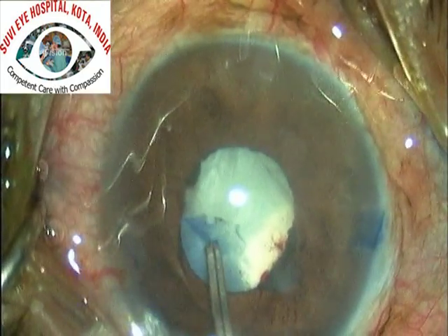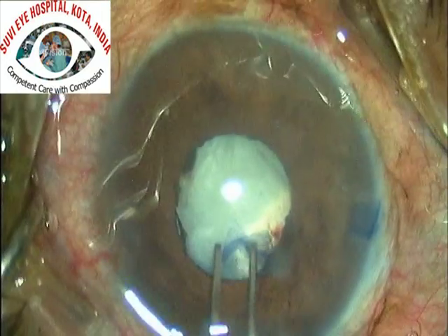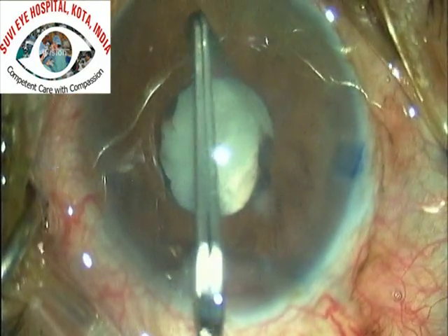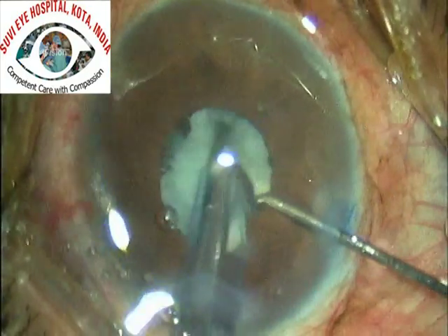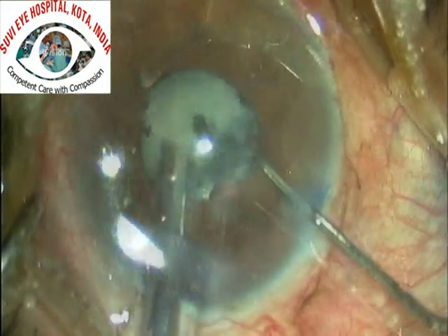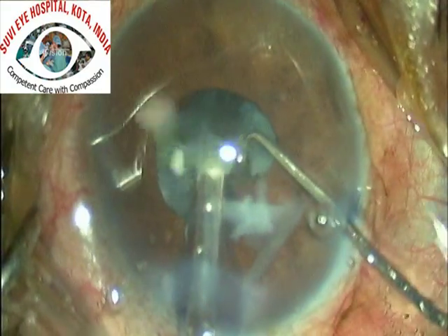Once we have an adequate pupil size, we perform capsulorrhexis, which again has to be very careful because the capsule may be fibrotic and adherent to the iris. This capsulorrhexis may have to be performed exactly at the pupillary margin in cases where the pupil is not sufficiently enlarged. Once we have an adequately sized pupil and a good capsulorrhexis, the rest of the surgery is not particularly difficult compared to other surgeries.